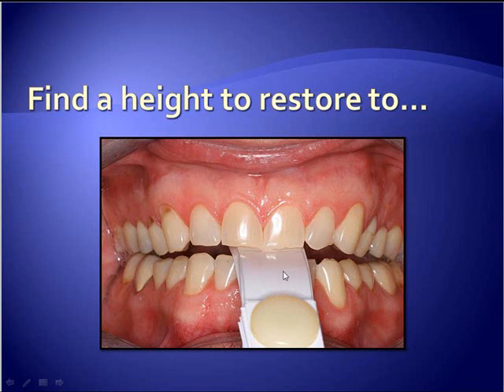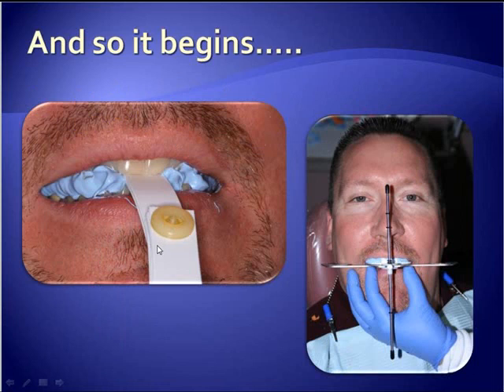Simply experimenting with the right height and then visualizing where that patient has to be for you to place the restoration. Once the patient is at that height, you have them slide forward, slide back, and clench — repeatedly — putting them into what amounts to centric relation, and then capturing it with a polyvinyl siloxane bite registration material. In this case, this was Parkel's Blue Moose.